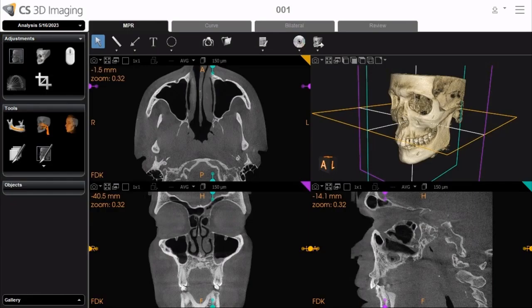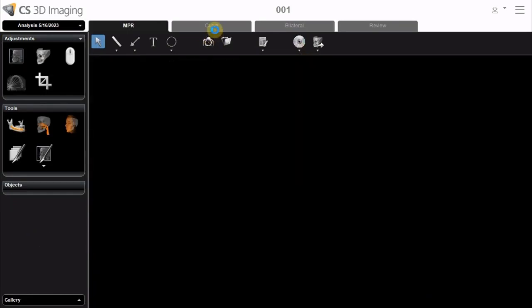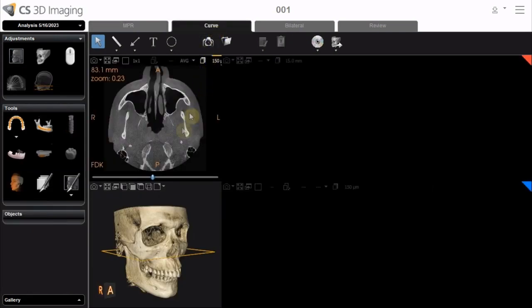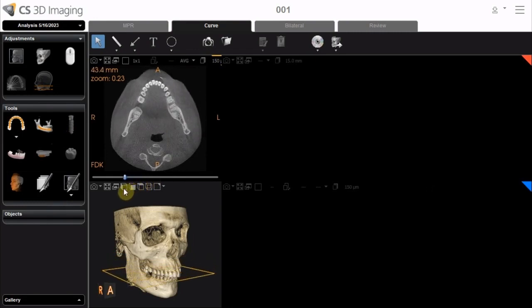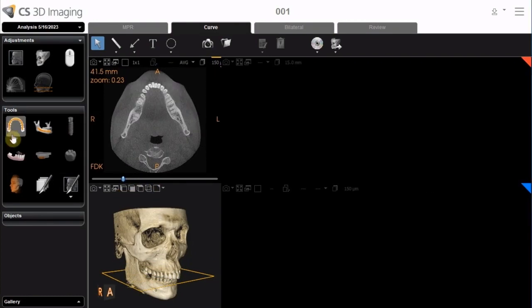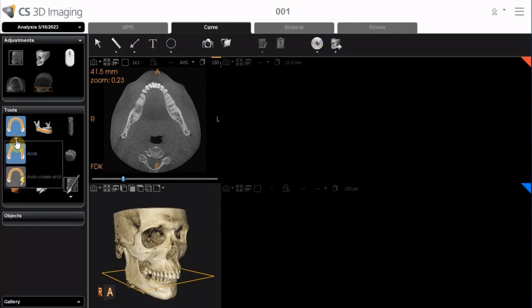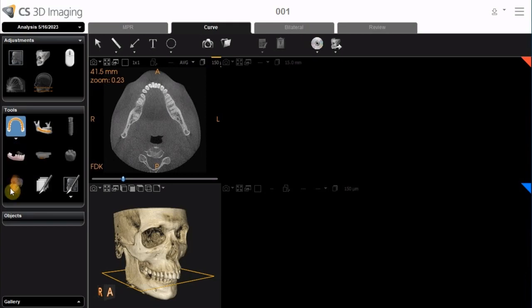Tracing the Dental Arch. To draw a trace along the dental arch, follow these steps. Select the Curve tab. Click and drag the slider at the base of the Axial Slice View screen to display the region you are interested in. In the Tools pane, click to activate the Manual Tracing tool, or, using the Extended List, click to automatically trace a dental arch.